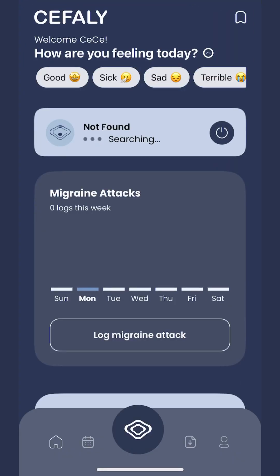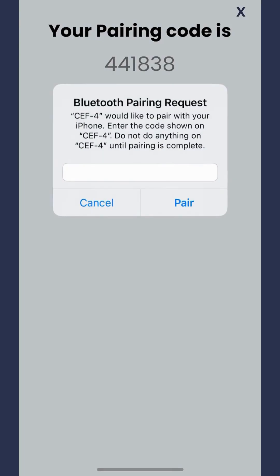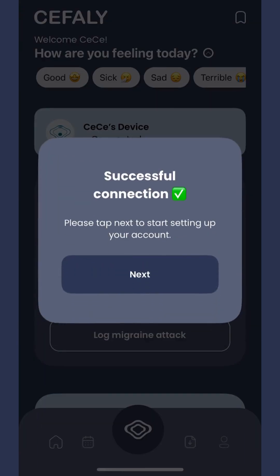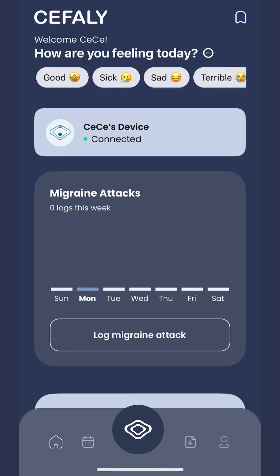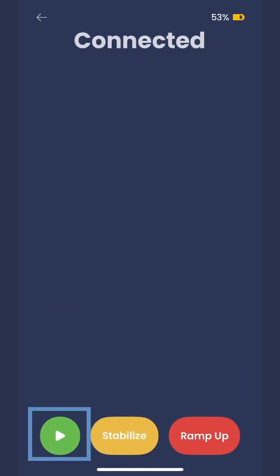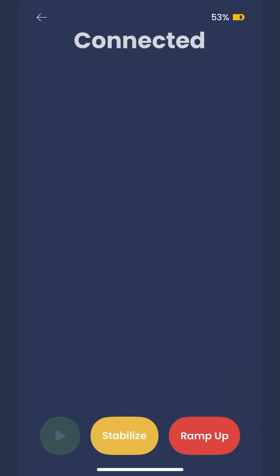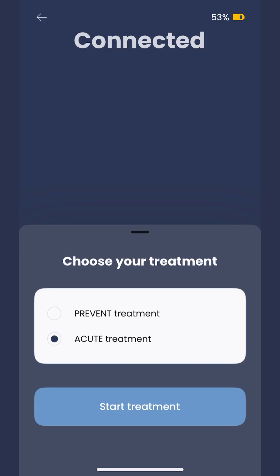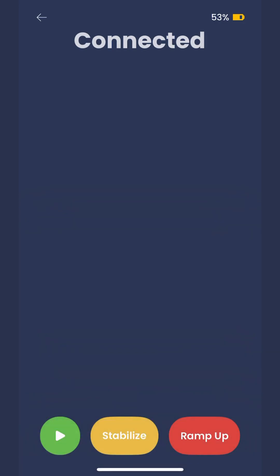First, connect your device to the CC app, then attach Cephali to the electrode. Tap the blue Cephali logo button, then the green play button. Choose acute treatment and tap start treatment.